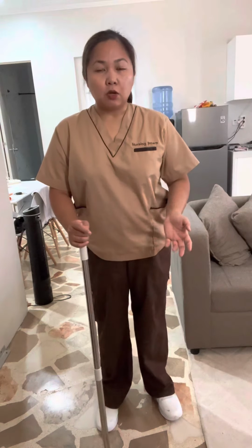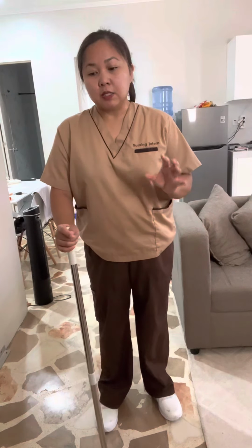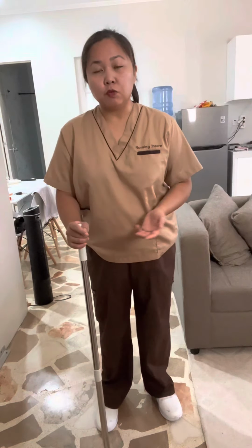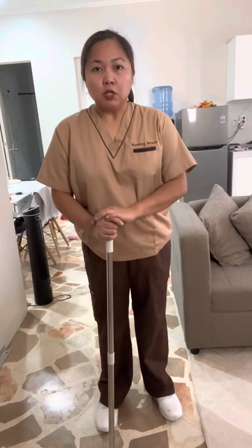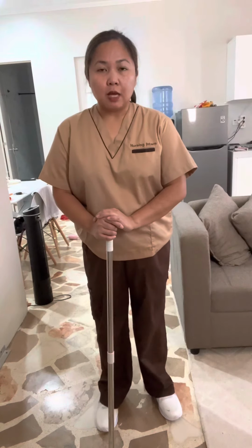And then document all of this procedure with the patient and what time it is, and do your evaluation later to see if they're comfortable, if they're okay. Just assist them if they need to be repositioned in their bed or in their desired position or destination. So that will end my return demonstration for assisting a client in ambulation using canes.